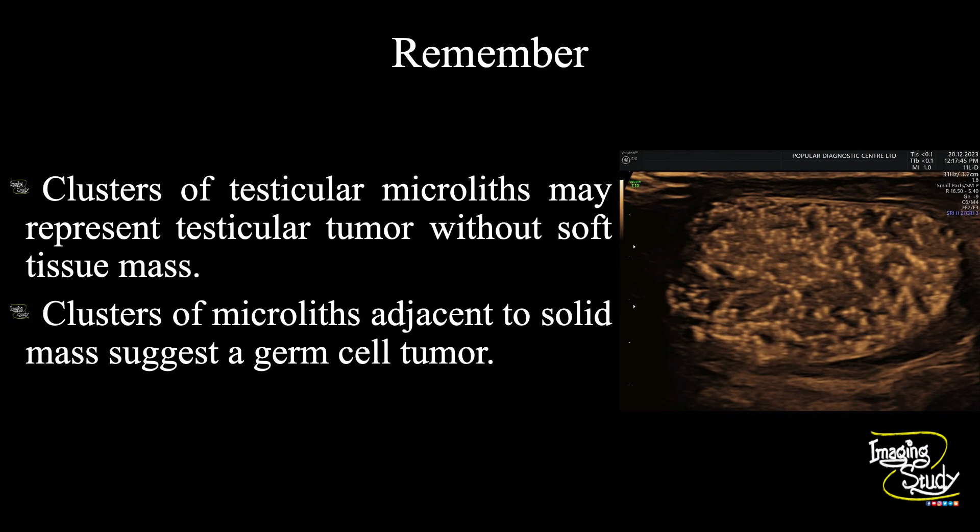If you see testicular microlithiasis in a focal area, that cluster of testicular microliths may represent a testicular tumor. And if you see clusters of microliths adjacent to a solid mass, it indicates a germ cell tumor.